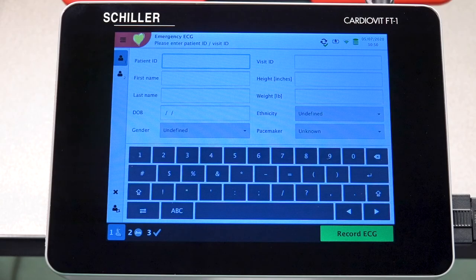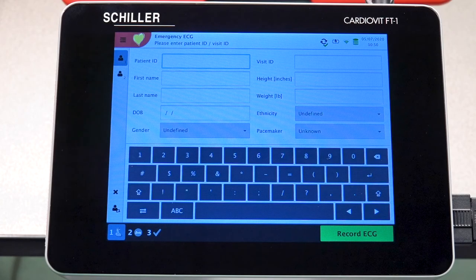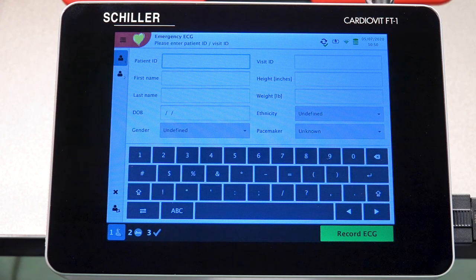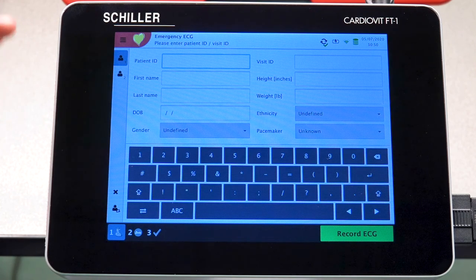Upon powering up the device, the unit will automatically go into the patient data screen. You can begin by entering your patient ID. If you choose to leave it blank, that's fine — just know that the unit will automatically generate a random patient ID.